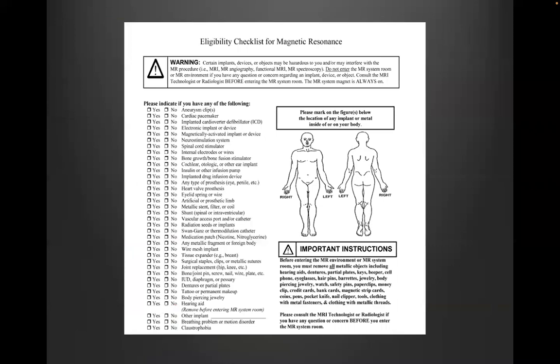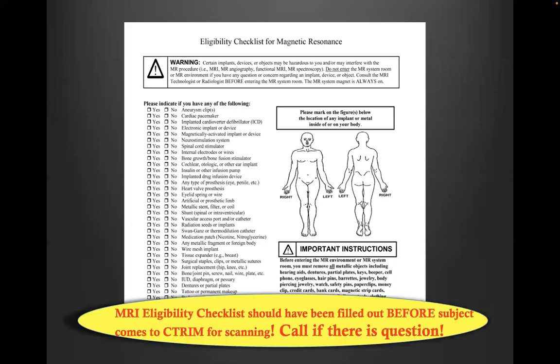So this is our eligibility checklist. If you don't have it, you should contact us to get a copy of that. And you should go through your checklist before your patient comes to us for scanning.